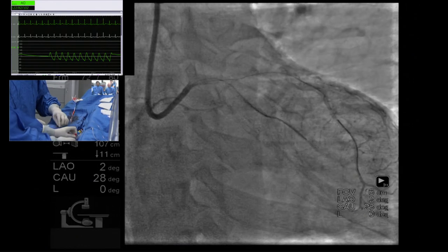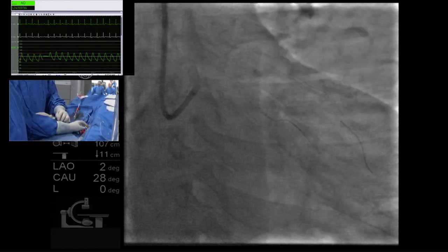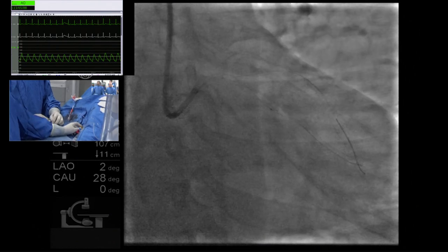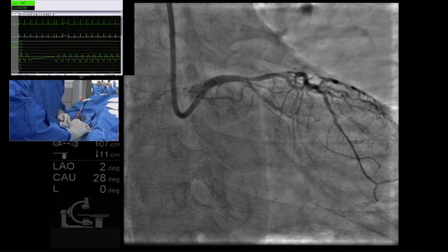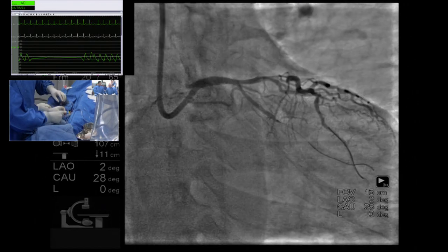Yeah. So just to clarify, are you asking whether you stent a vessel with no disease where it looks like the left main is narrow? So that's the whole point of intravascular imaging, right? Because the angiogram just doesn't capture the left main particularly well, right? Okay. This looks wonderful.